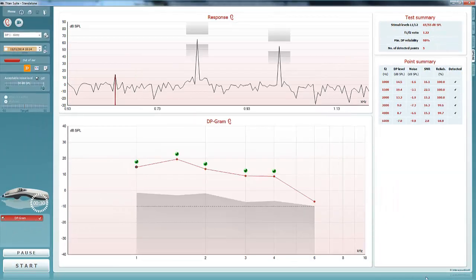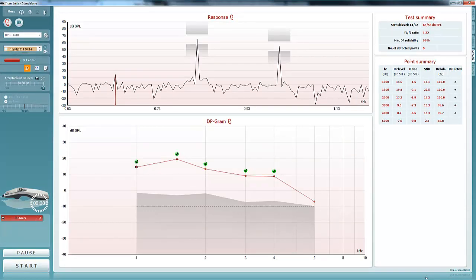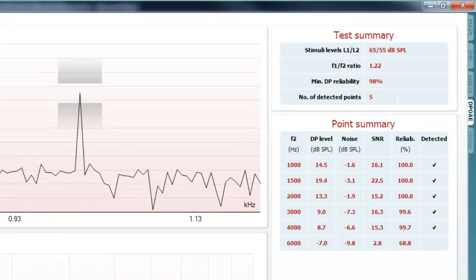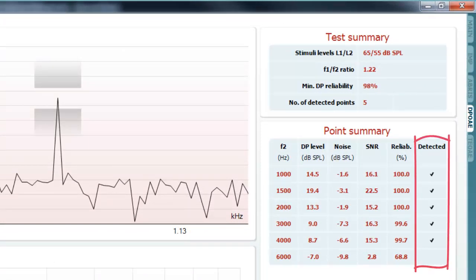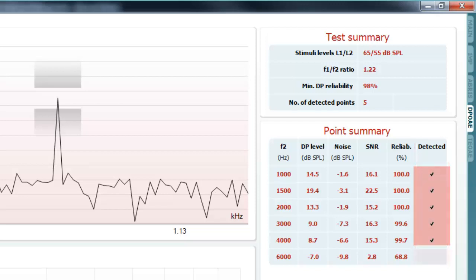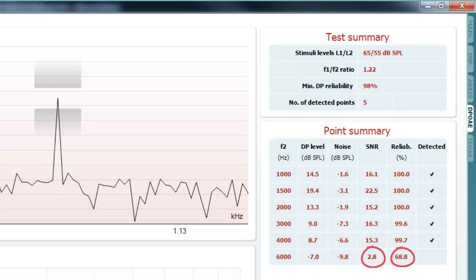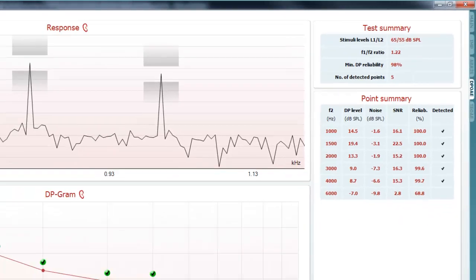Once the DP gram has been measured using Titan, you can interpret the OAE by using the DP gram or the points summary table. The points summary displays OAE data numerically. The detected column will display a check mark if the pass criteria are reached. If a check does not appear in this column, then the pass criteria has not been reached. The table can then be examined to identify which criterion or criteria it failed to reach.